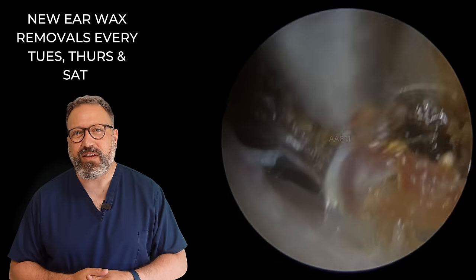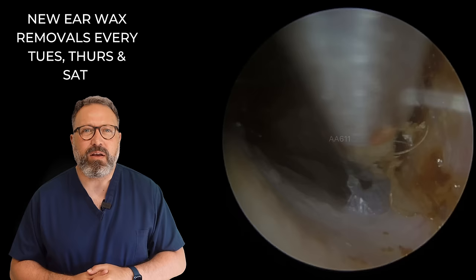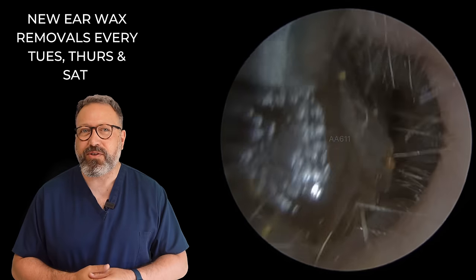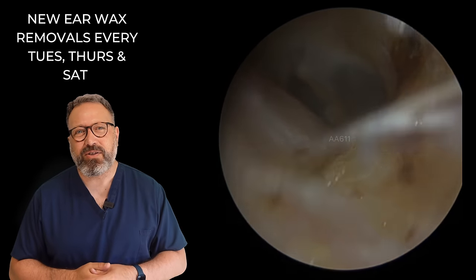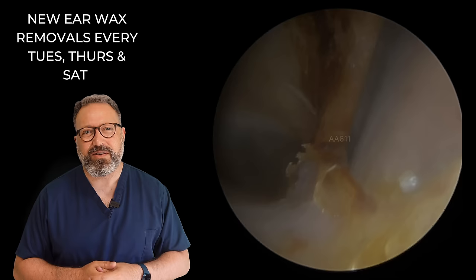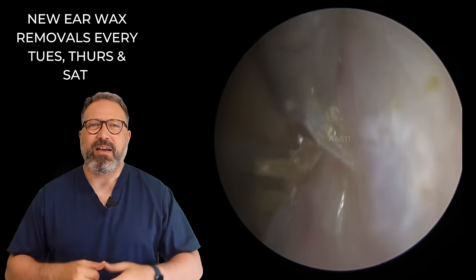You can see it flicking up there in front of the suction machine. If you look just underneath, you'll see that layer goes all the way back right underneath the plug we're trying to move. We get some turbo wiggling going on — we've managed to loosen it now and detach it from that skin layer. The skin is still in there though. So we've got that plug out — let's have a look at the skin. You can see it going all the way from the bottom up to one side. Let's use a fine end and see if we can lift this dead skin — let's see how far back this goes. You can see how it just peels away from the side, all coming away from that canal wall there — really having to peel all this very old, hardened dry skin layer off the canal wall.